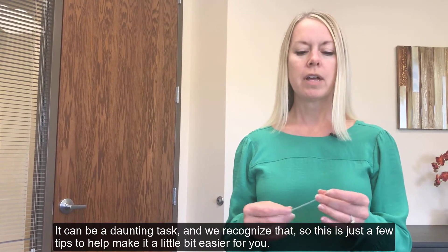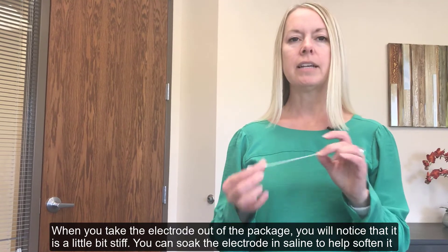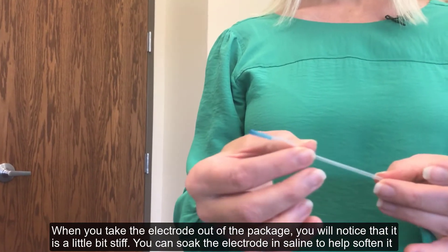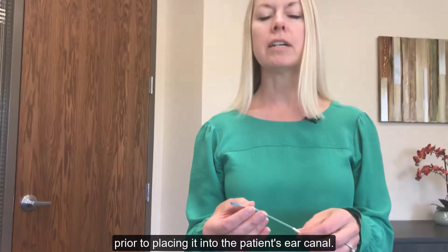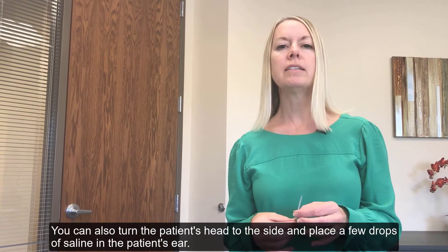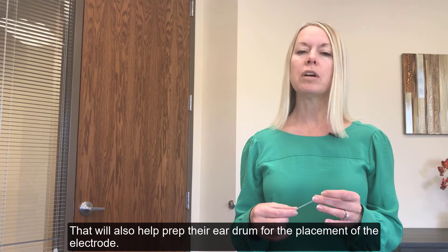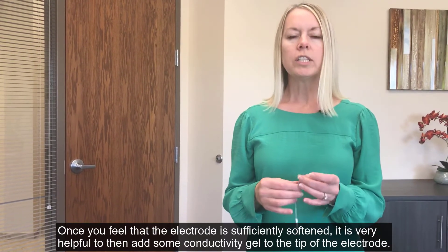When you take the electrode out of the package, you'll notice that it is a little bit stiff. You can soak the electrode in saline to help soften it prior to placement into the patient's ear canal. You can also turn the patient's head to the side and place a few drops of saline in the patient's ear — that will also help prep their eardrum for the placement of the electrode.